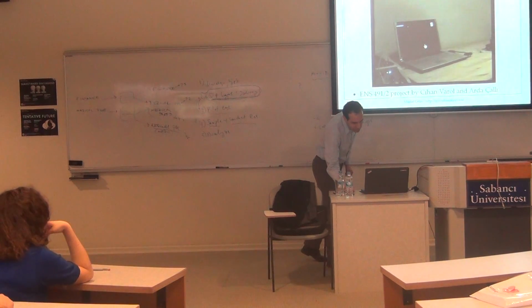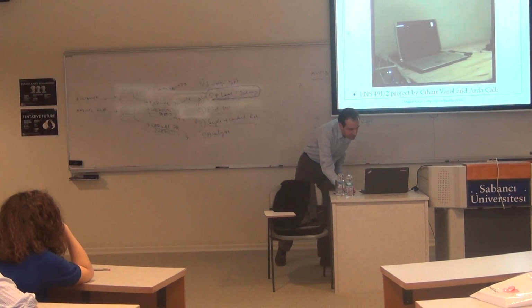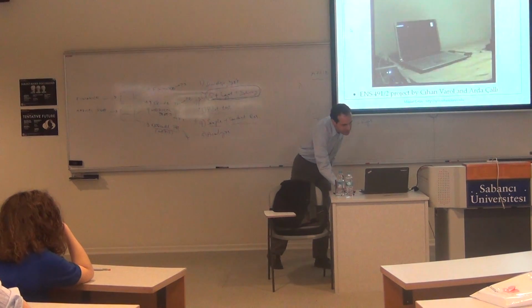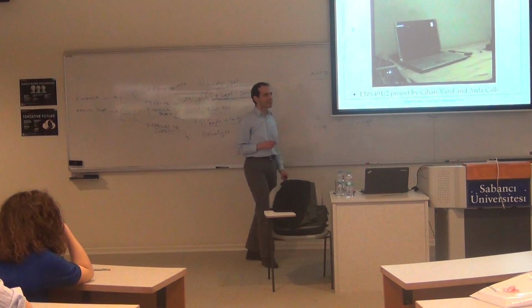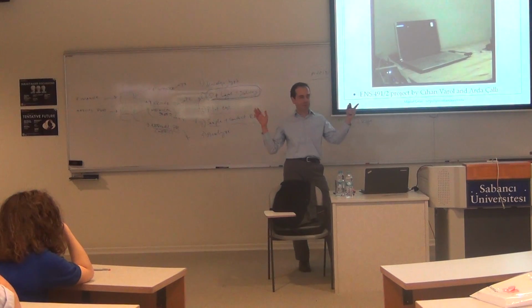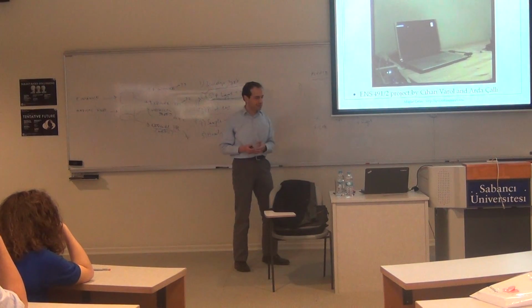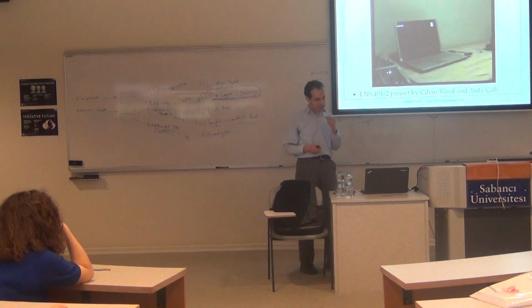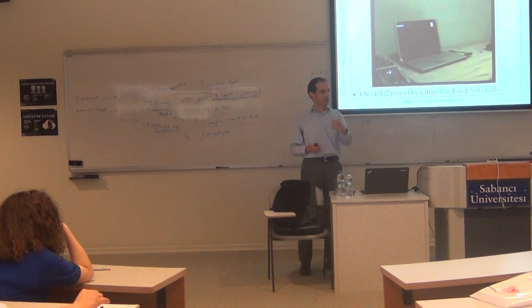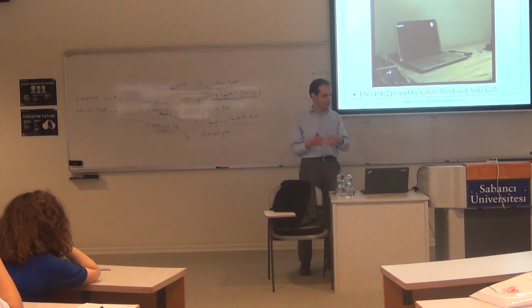Let me show this to you quickly, if I might. So this is the reason I'm showing it. Okay, let me first. This is from an undergraduate project. This is just to make the point that undergraduates can also do research in this area quite successfully. Up to this point, I showed you this P300 interface using a matrix environment. There are other ways in which you can use P300 signals, and this is one example. In this case, what you are doing is that you are showing the person some images sequentially. The person is interested in one of those as the target, and picking that and then generating a response.